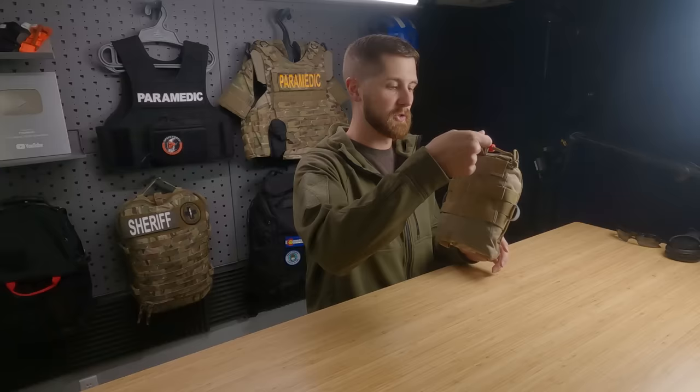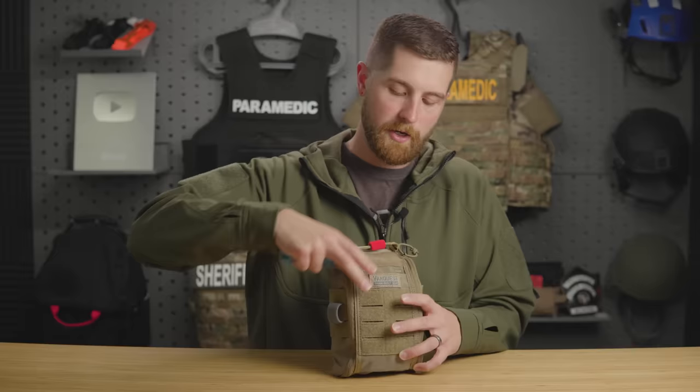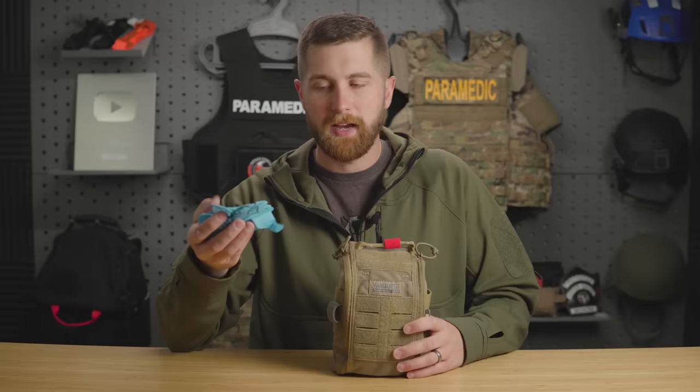So in the front, there's this cool little pocket in here, and it will actually Velcro shut. So that's multifaceted. Number one, it holds your PPE, so your gloves. It's a good thing to have just on the outside of the kit.